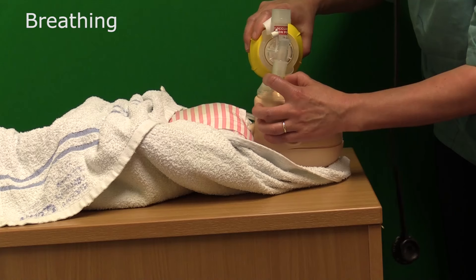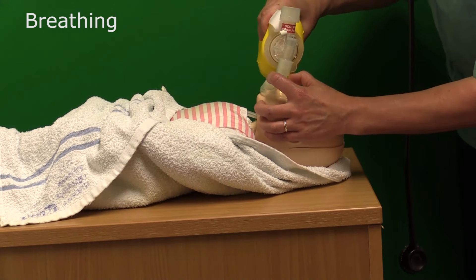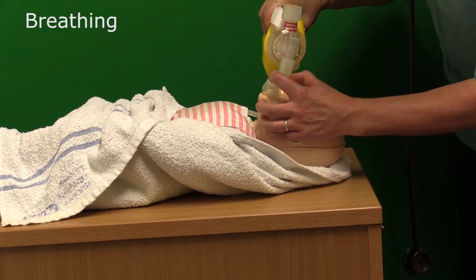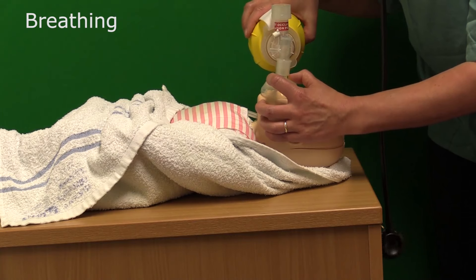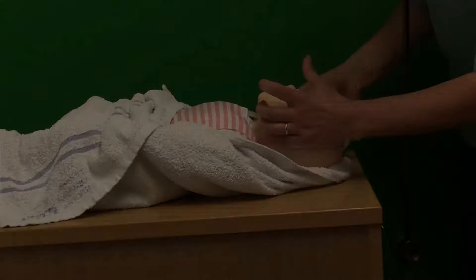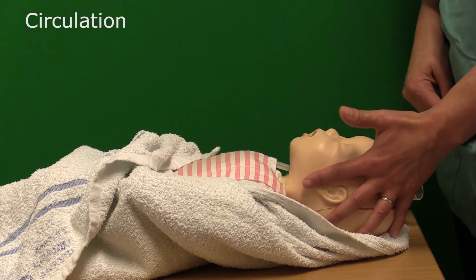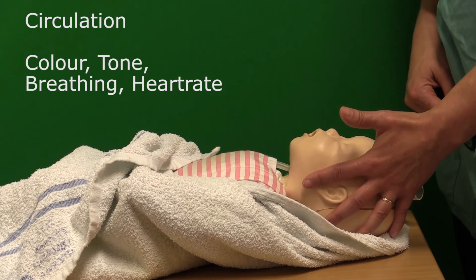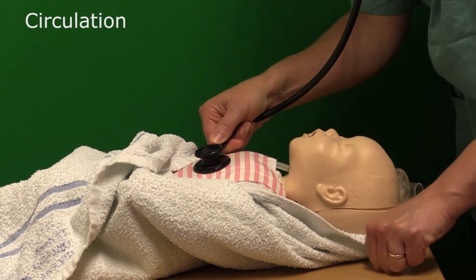When you're giving these inflation breaths, which should last two to three seconds each, you should watch the chest to see if it is rising, indicating that your inflation breaths are working. If you don't manage to see any chest movement, you need to reassess the airway — the head may need to be put in a different position. Once you have given your five inflation breaths and think they have been successful because you have seen the chest rise and fall, the baby should be reassessed again: colour, tone, breathing, and heart rate. The heart rate is checked with the stethoscope, tapping out the rate so the professionals around you know the condition of the baby.